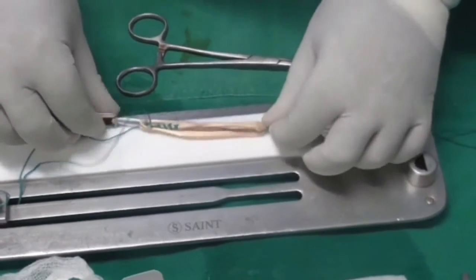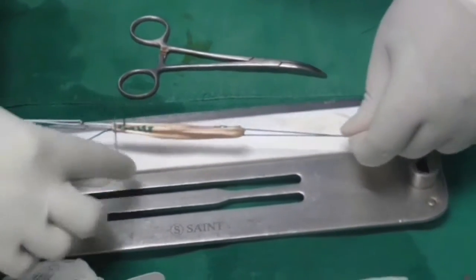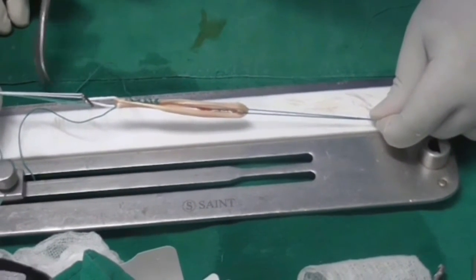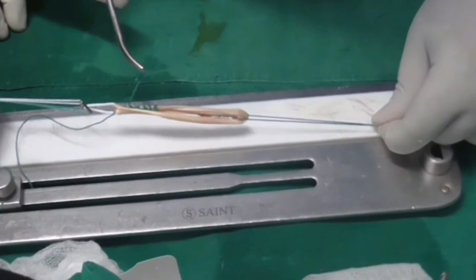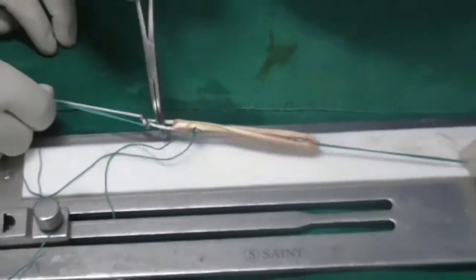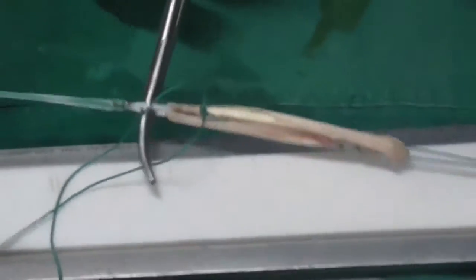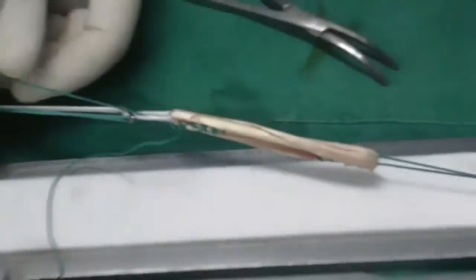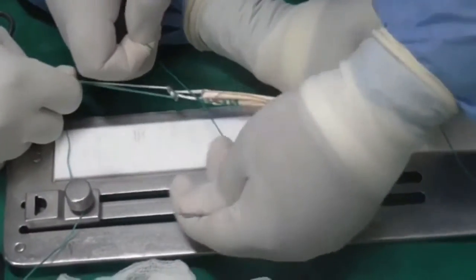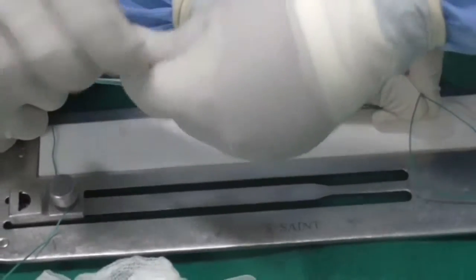Now a very important step is to fix the one end — the end towards the loop — to the loop. What we have to do is take both limbs of the ethibond suture and loop them into the loop of the endobutton, making two knots on one side. We have taken it through the loop of the endobutton and are making two knots.